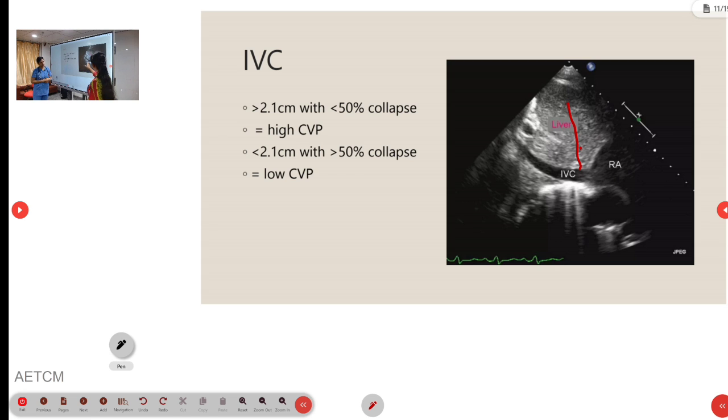And aorta will be having that celiac artery opening, which might also be seen in the aorta. Based on the thickness of the wall, we can find whether it is aorta or IVC. So we will have to measure the breadth of the IVC. Where will you measure it? One centimeter from the opening of the hepatic vein. Here we will have to check the IVC size.